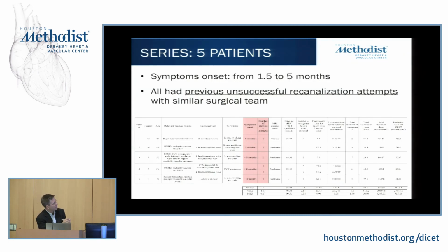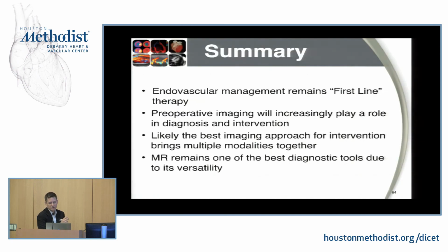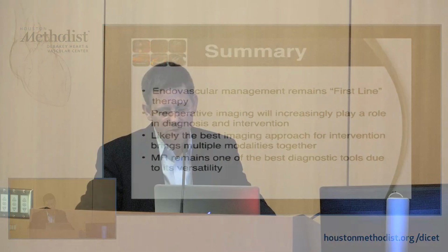They've looked at their abilities to fuse those images together in a series of several patients where basically they were unsuccessful previously, and then with image fusion and specific guidance, we're able to recanalize all those patients. So endovascular treatments for us remain sort of our first line. Imaging, perioperative imaging, or pre-op imaging, and then post-op imaging, hugely important for us. And the imaging approach really helps to guide our interventions and treatments for these patients. Thank you very much.